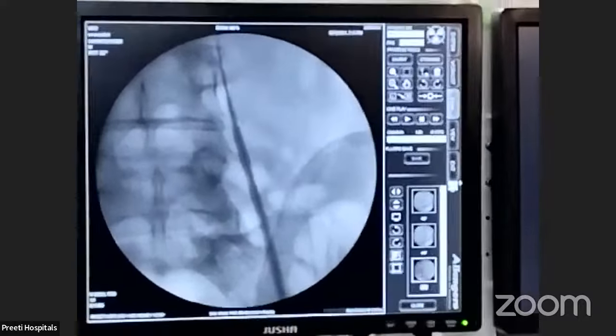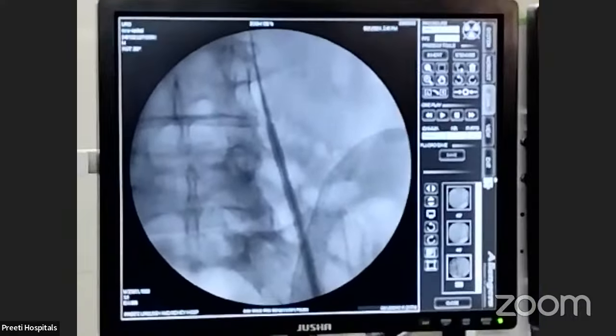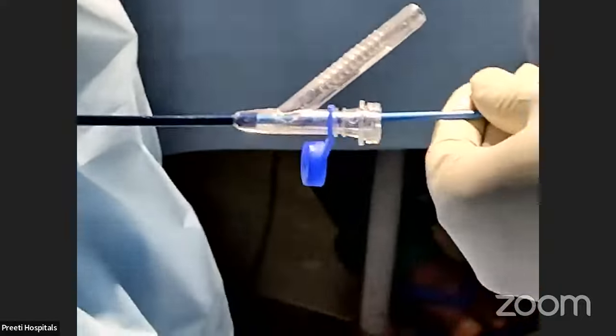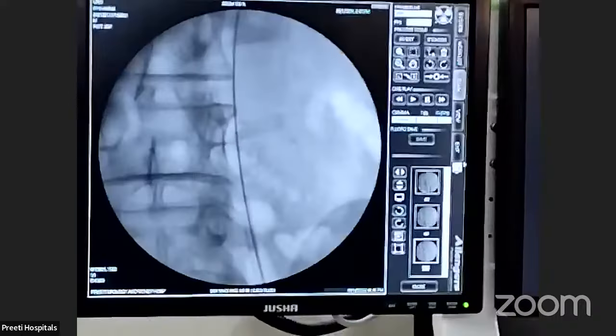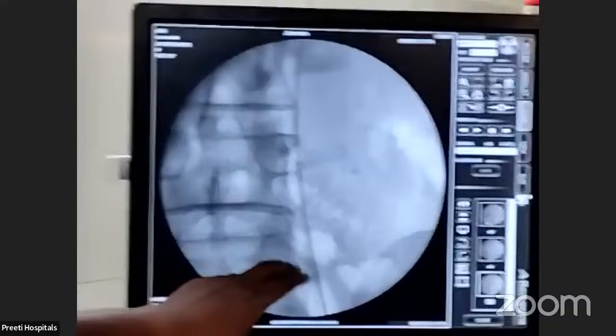In that case, what will we do? We will go, see arm. We will stop here. We will take out the access sheath there. Now you show the position, how it can be threaded, see arm. Show with finger, where is it? So we are very good. Now you take it out.